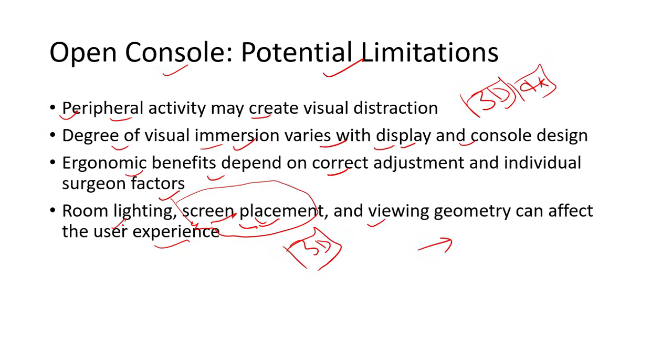So the geometry can affect the user experience. If the surgeon is sitting a little to the side, or the monitor is lower or higher than their height, that will affect the surgeon's experience.